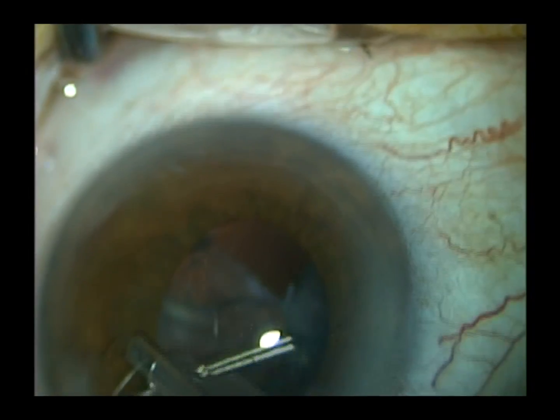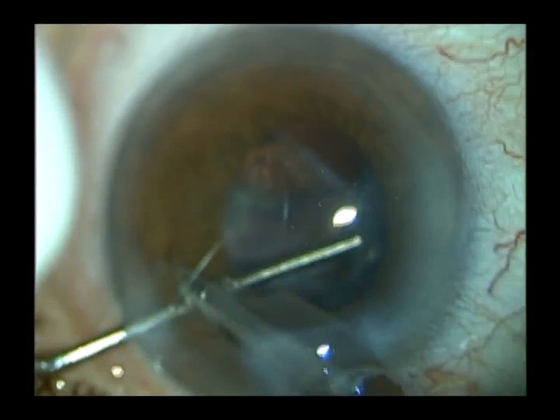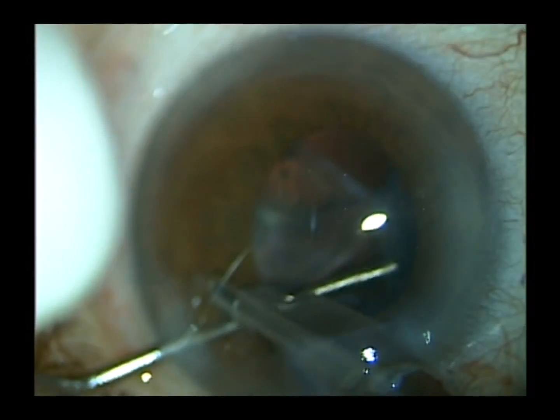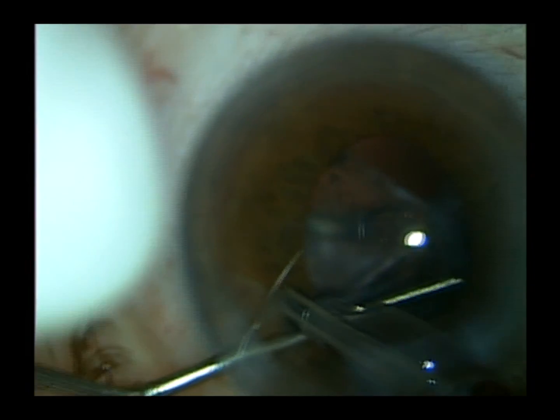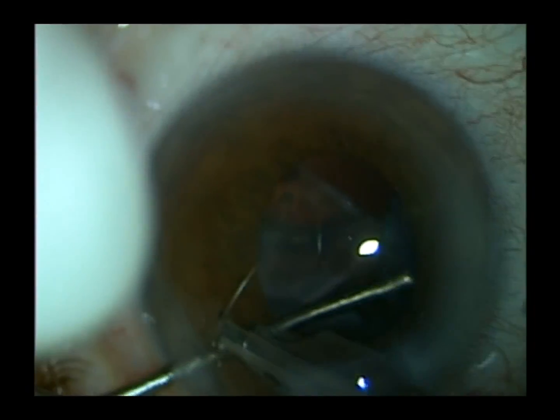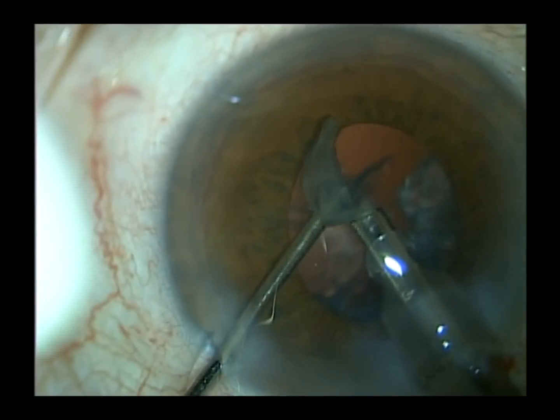I've now gotten most of the nucleus, but we'll spin these small remaining fragments around so they're easier to remove. There's usually some material that can get stuck near the paracentesis port, so we grab that piece as well.